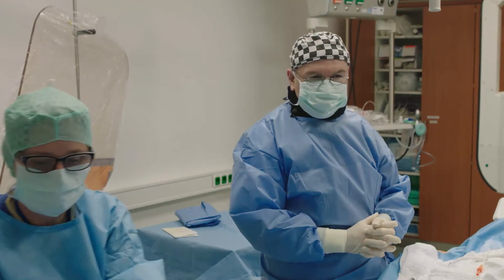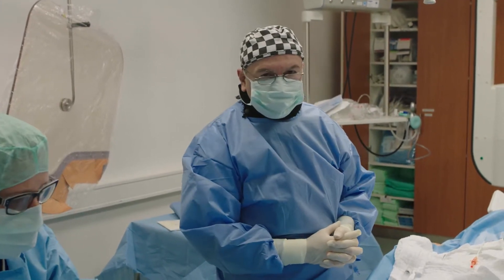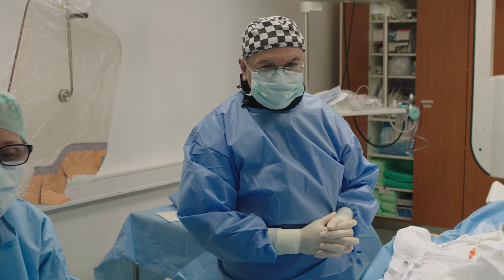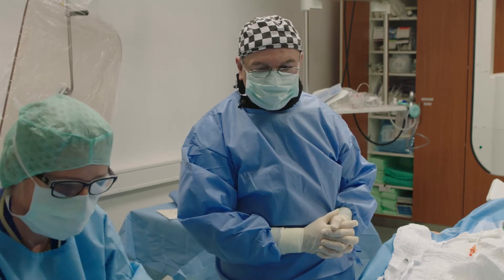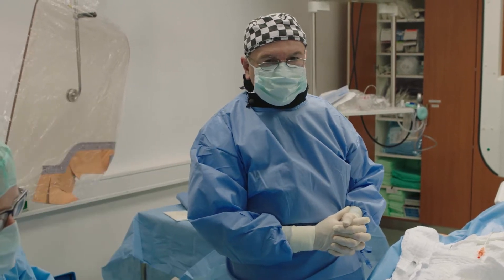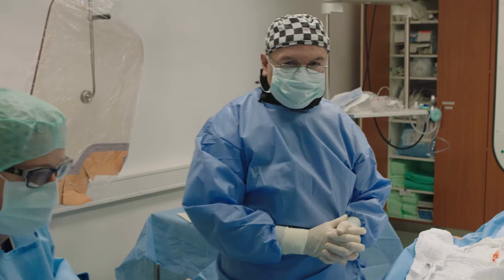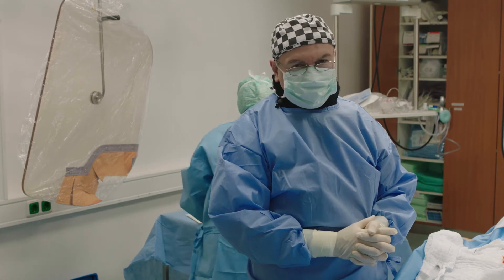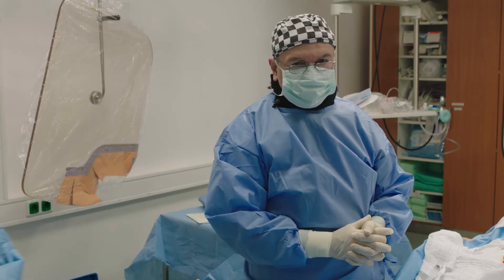Welcome here in our hospital in Darmstadt, the clinic in Darmstadt, where we'll treat a patient with a right coronary occlusion. He's 58 to 59 years old. He has symptoms of dyspnea for about five years during exercise, and about two to three months ago he underwent a coronary angio, where coronary three-vessel disease was diagnosed with RCA occlusion in the mid-segment, about 25-30 mm, which is our target lesion, because he has severe ischemia on myocardial scintigraphy in this area.